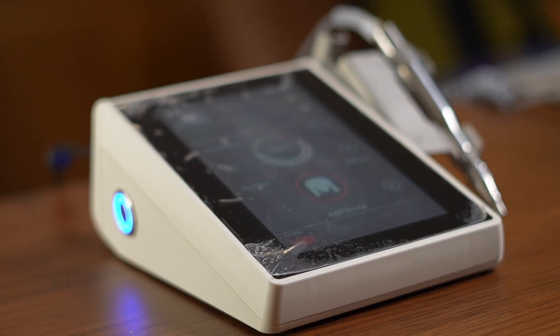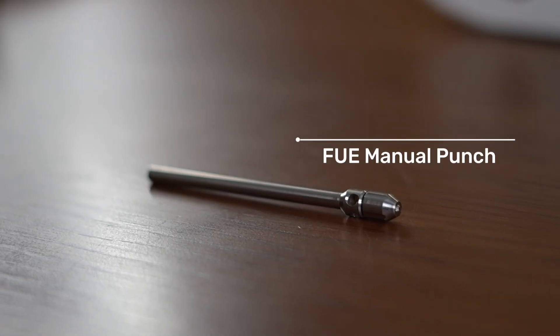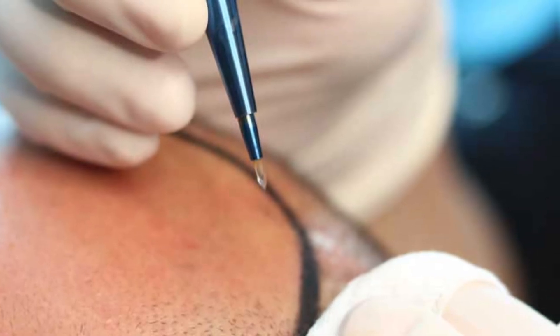The motorized devices fall under two different categories: the standard rotation device and the oscillating machine, with many different machines and settings — it does get quite complicated. The manual device is specifically good for targeting individual hair follicles, especially for repair cases. It leaves a tiny punch mark, however it can take a lot longer and is a lot more tedious. This sort of oscillating device is really good for a small number of follicles — you can target them without damaging them.